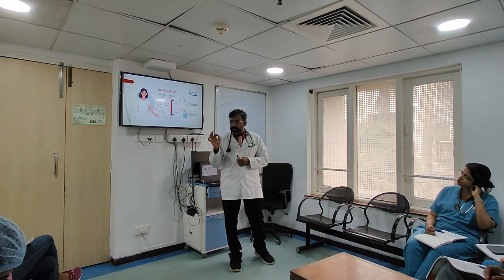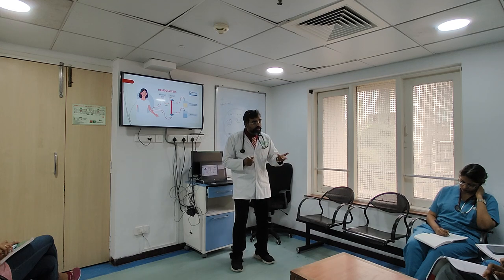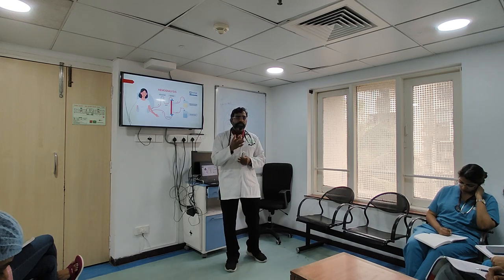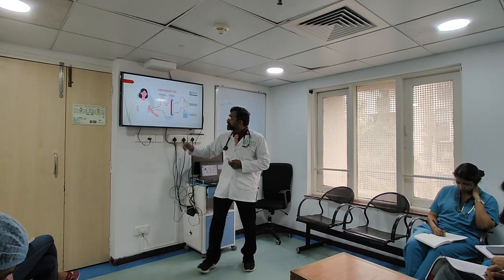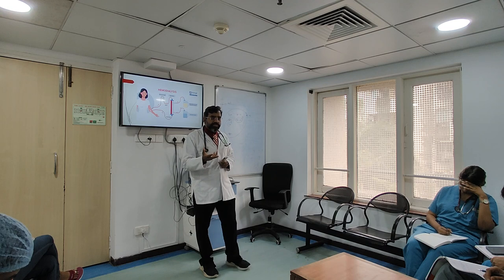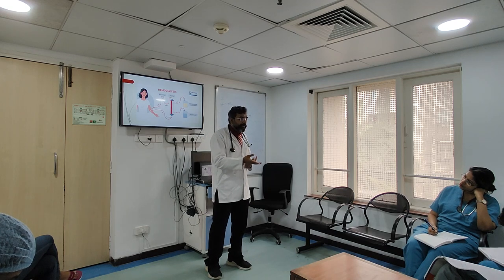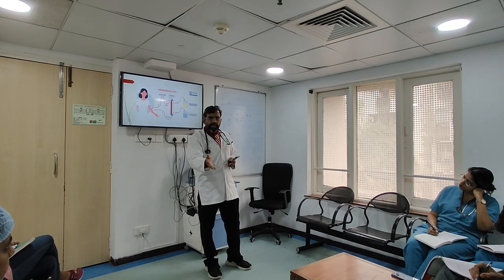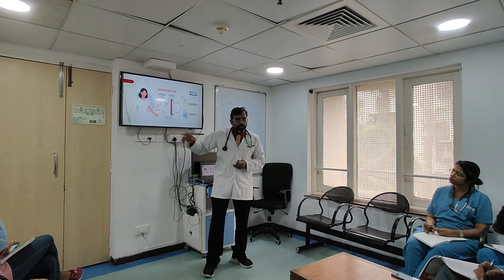Then another important part is the first time any patient undergoes dialysis. What happens? Reaction to a foreign body. You have a patient who has never been exposed to dialysis, and the first time they undergo dialysis, you are taking it into the ICU. The moment you move the blood from here to here, these membranes are artificial membranes. There can be a severe allergic reaction that will drop the blood pressure majorly. Classically this will occur immediately, not like UF, which takes a while and then drops the blood pressure. So you will immediately have a febrile reaction, probably an allergic reaction, and the blood pressure will start dropping. That is what you must remember.